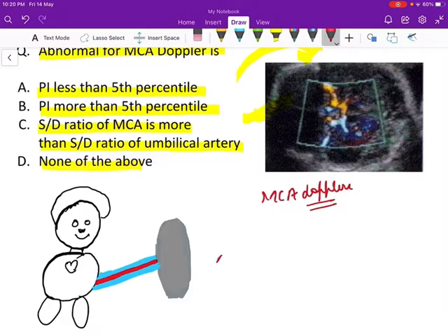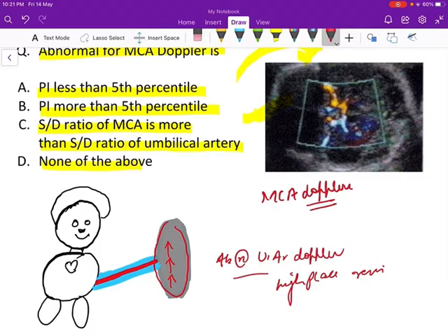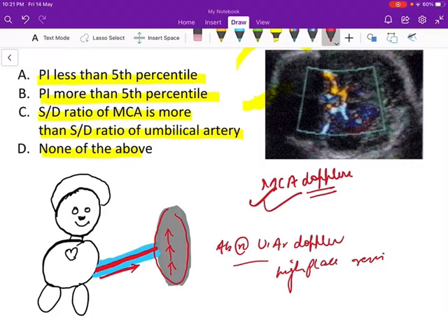MCA Doppler is interpreted when the umbilical artery Doppler is showing something abnormal. Abnormality in umbilical artery Doppler means there is high placental resistance. When the resistance in the placenta becomes high, the umbilical artery draining to the placenta shows abnormalities — there is impaired fetoplacental circulation. Through MCA Doppler, we assess the fetal response to this increased placental resistance.